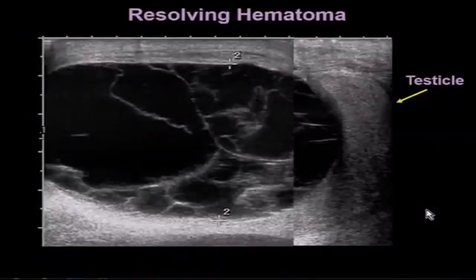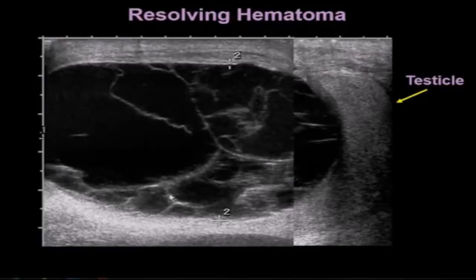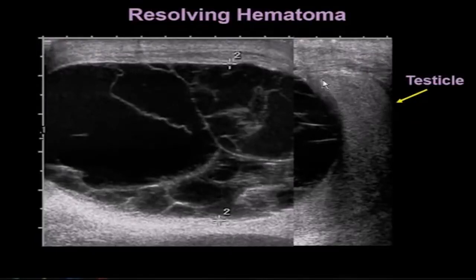This patient has a hematoma that is resolving. We can see the typical web-shaped crisscrossing septations across it — this is a typical appearance of a resolving hematoma. Again, this is compressing the testicle inferiorly.